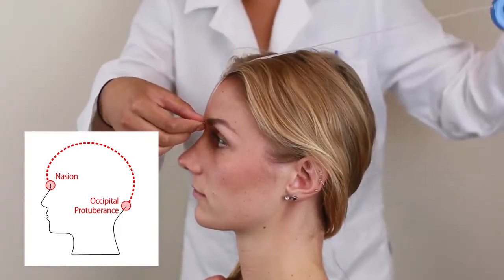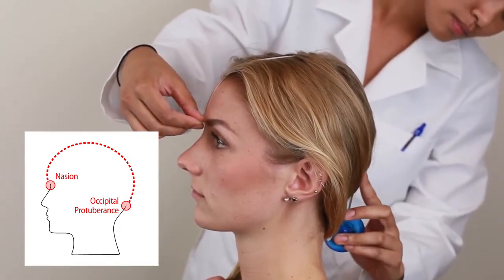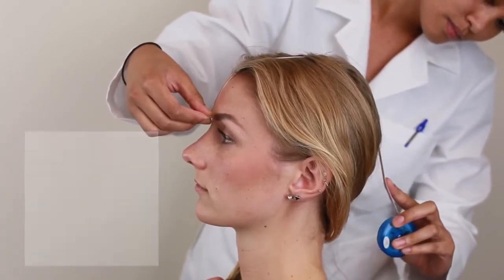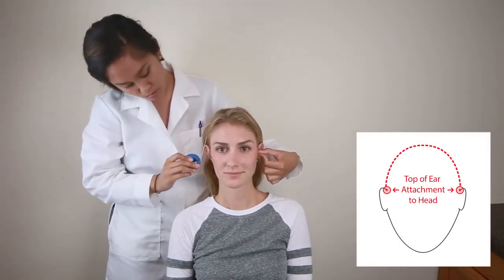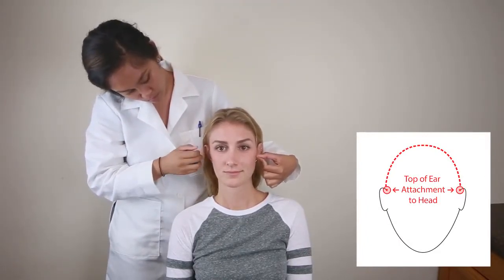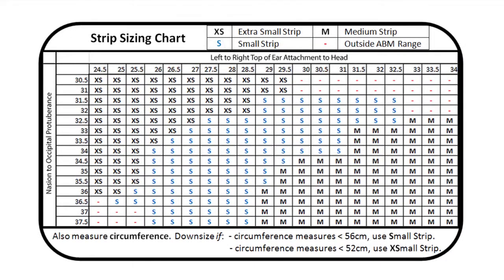Next, locate the nasion and measure over the midline of the participant's head, ending at the bottom of the occipital protuberance. Record the values. The second measurement requires that you measure laterally from the top of the ear attachment on the left side of the head to the top of the ear attachment on the right side of the head. Record the values. Your recorded measurements for both nasion to occipital protuberance and top of ear attachment from one side to the other will help determine the participant's strip size. The strip sizing chart provided will help you determine the participant's strip size. Find your recorded nasion values on the y-axis and the top of ear attachment values on the x-axis.